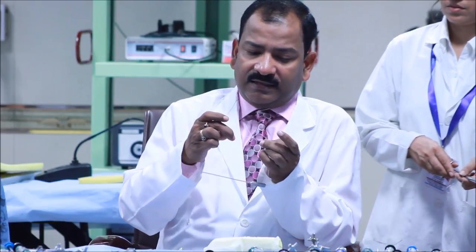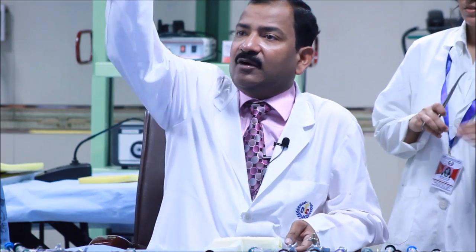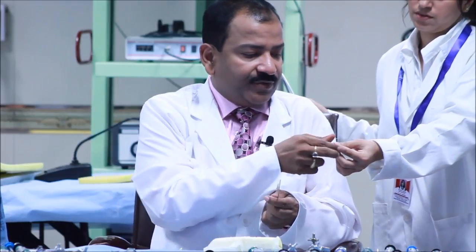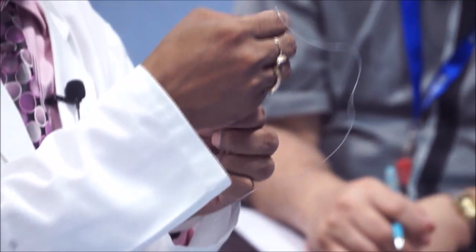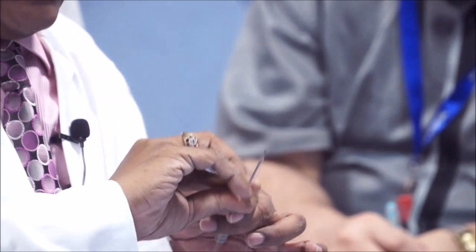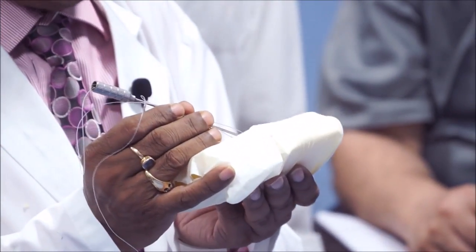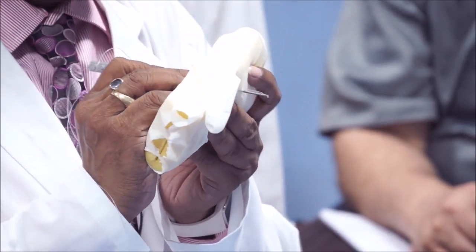Here the knot is tightened, and then hide it. It is hidden and it is now made. After that, what do you do? You take another suture, any suture, Vicryl, silk, PDS, whatever you want, and put inside this tip only 2 cm, and then bend it. It is bent. Now hold it like a dart. And suppose this is a port. Go by the side of the port, leaving the skin, don't hold the skin. And the rest of the layers you will puncture.